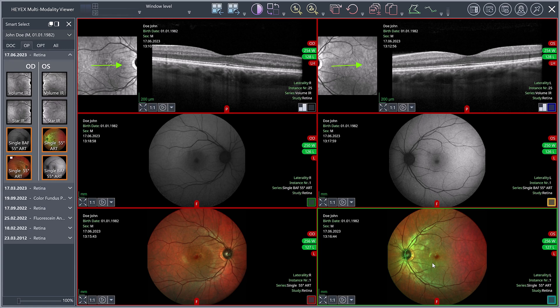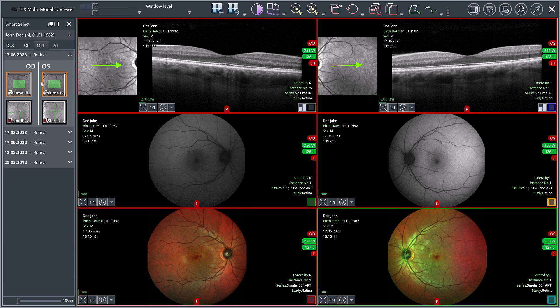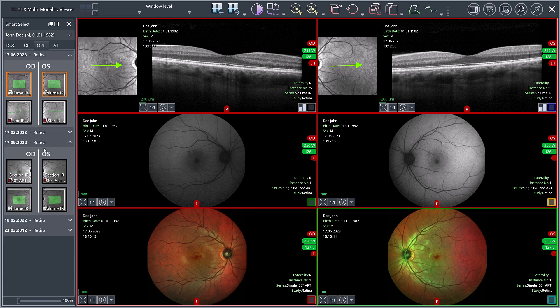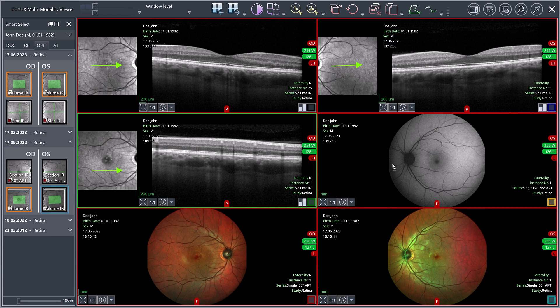With the Multi-Modality Viewer, you can view image data from one examination day as well as an entire examination history. The current viewport allows viewing either three follow-up examinations of the right and left eye or six follow-up examinations of one eye simultaneously. In our example, the fundus images are to be exchanged with OCT follow-up examinations. To do this, select the OPT tab in the Smart Select window and drag and drop the desired OCT follow-up scans to the corresponding three viewports.